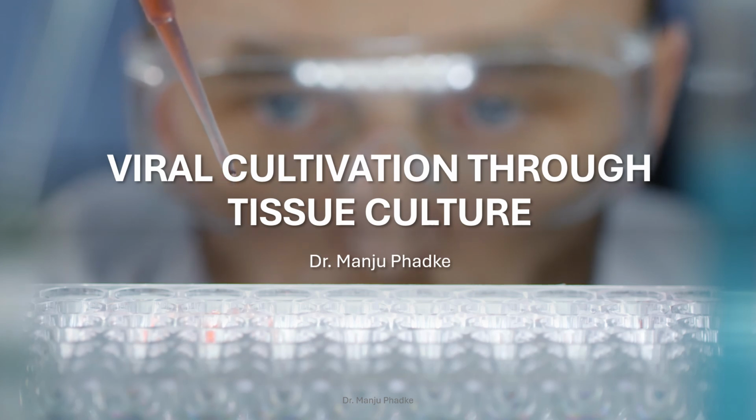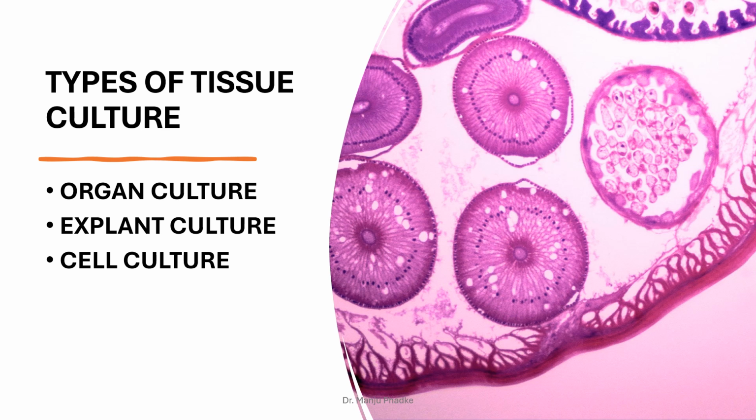They used poliovirus, which is actually a neurotropic virus, and they grew it in tissue culture using a tissue of non-neural origin. Let us see what are the different types of tissue cultures. You have organ culture, where small bits of organ are taken by biopsy and they can be maintained in vitro for days and weeks.